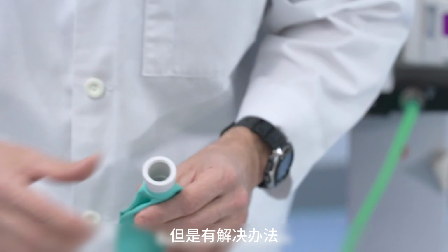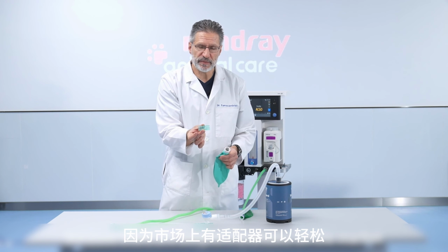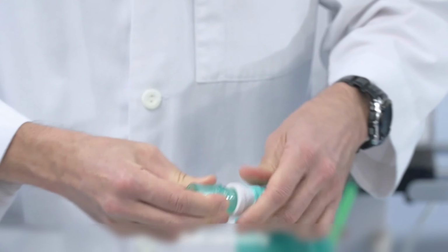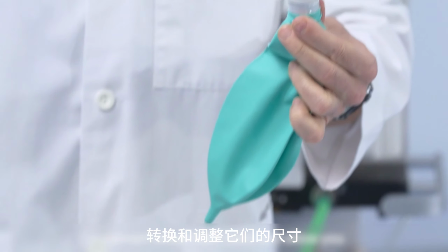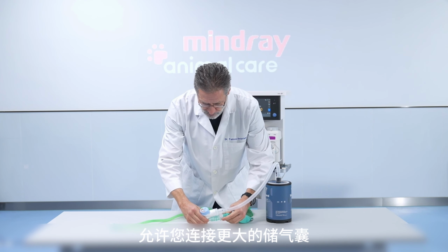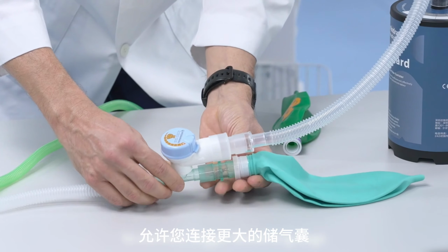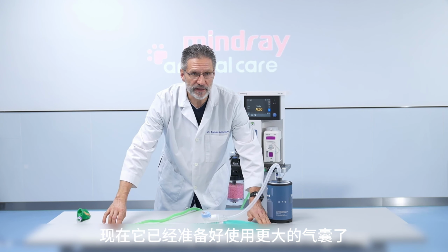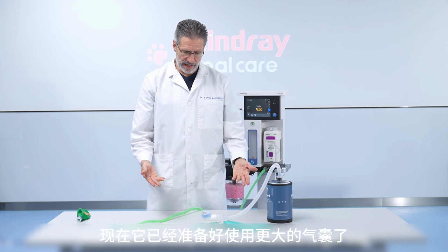But there is a solution, because there are adapters available on the market that can easily convert adapter sizes and allow you to connect bigger breathing bags to this non-rebreathing system, and now it is ready to be used with a larger bag.